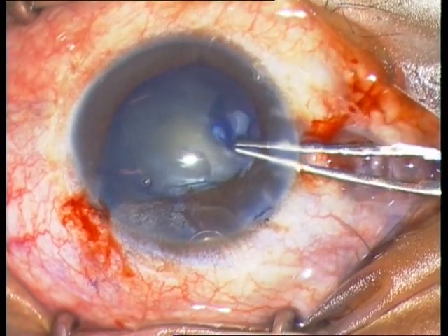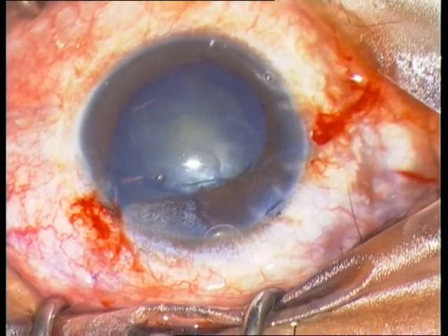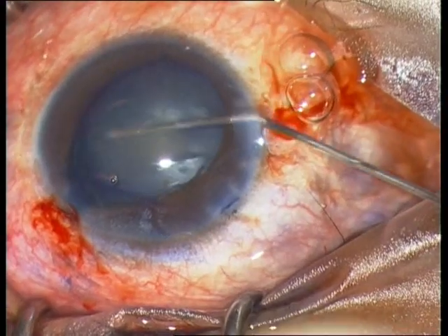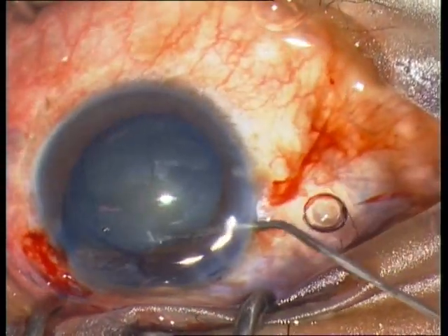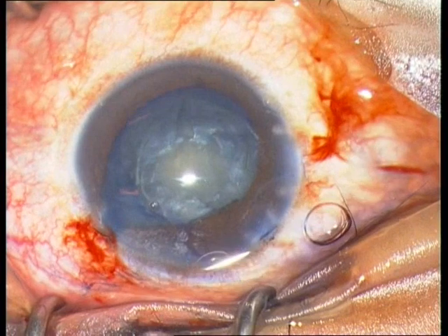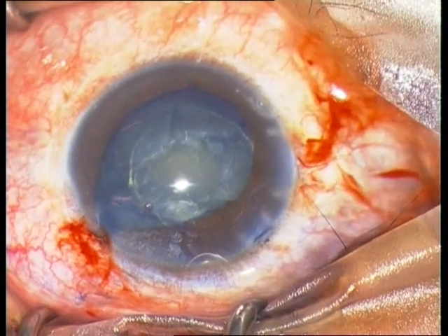Now it flows easier and I can perform a round capsulorhexis. The next step is hydrodissection. The nucleus is of course soft since the patient is only 27 years old, so phacoemulsification is not necessary and we can continue with irrigation and aspiration.